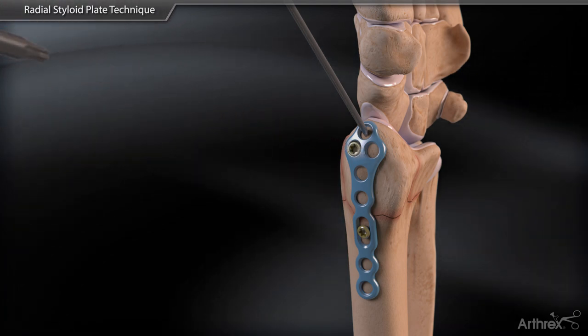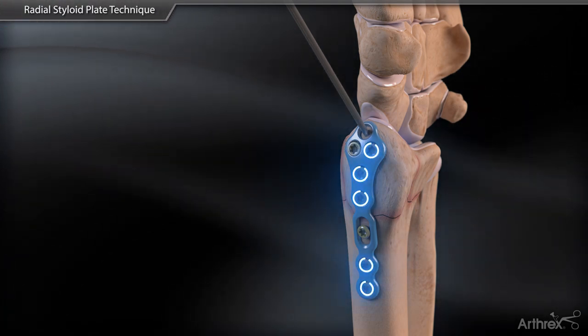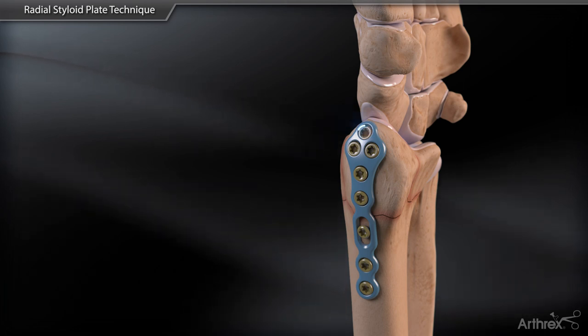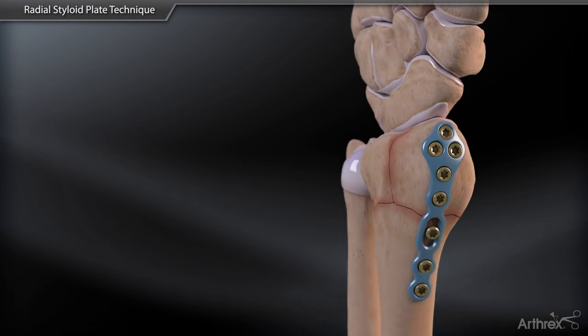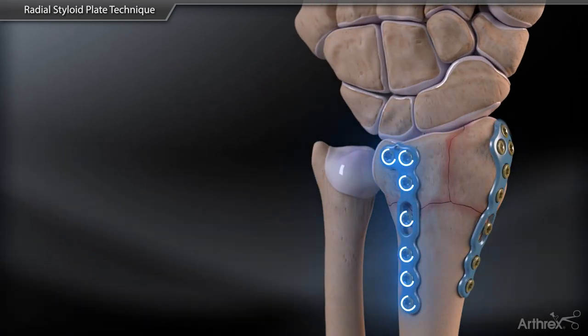The initial K-wire can be removed and remaining screw holes filled with 2.4mm locking screws. Additional fragment-specific plating options can be added as needed, depending on the fracture pattern encountered.